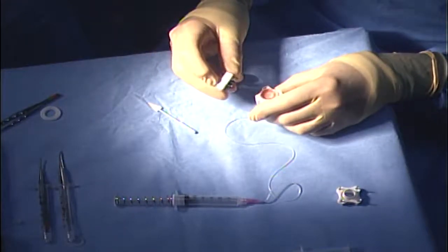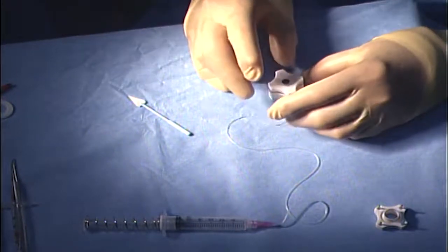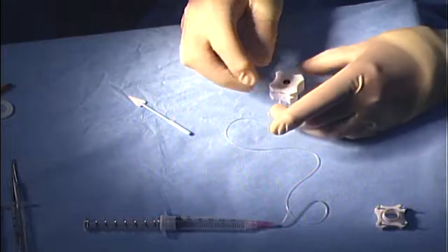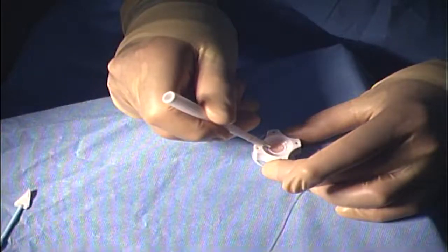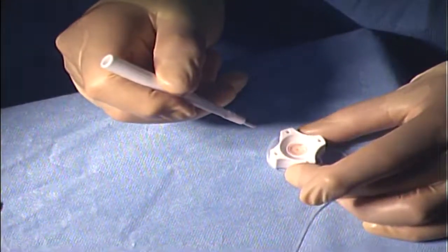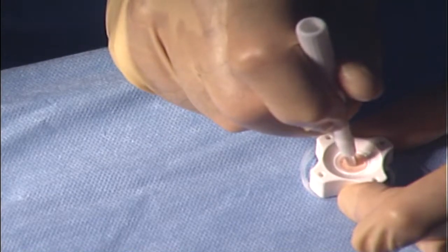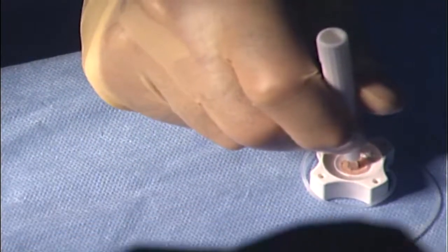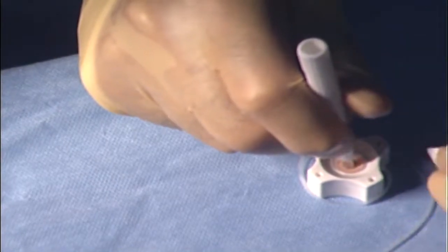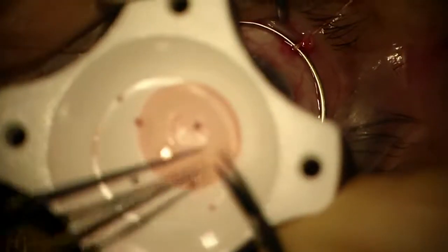So I'm now cutting an 8.5 millimeter carrier donor. This does not have to be a high quality endothelial donor since the cell count is unimportant. Now I will take the Boston keratoprosthesis and the dermatologic punch. So we now have the cornea with a hole in the center, 3 millimeter opening.